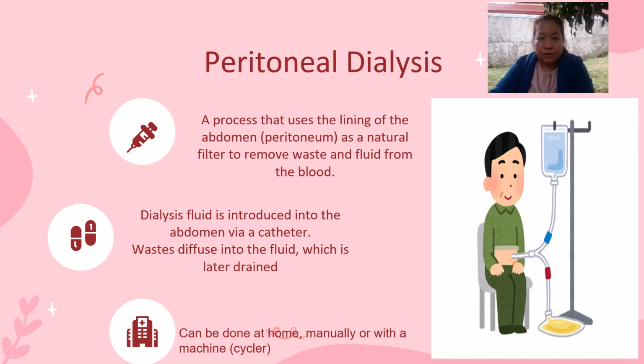Dialysis fluid is introduced into the abdomen via catheter. Waste diffuses into the fluid, which is later drained. It can be done at home, manually, or with a machine.